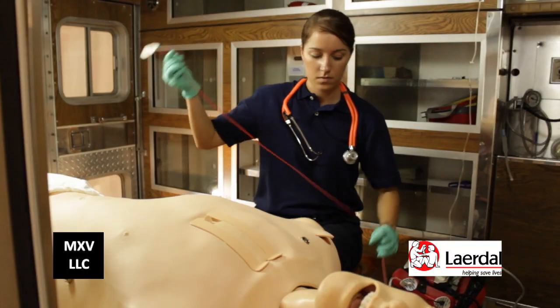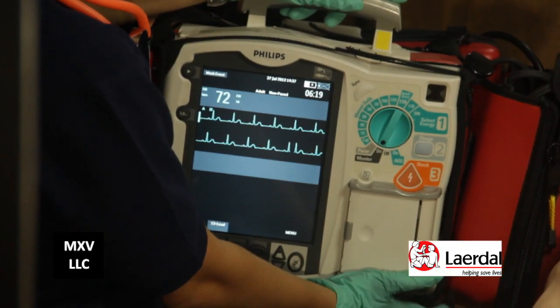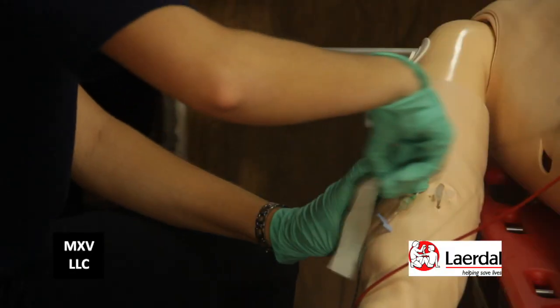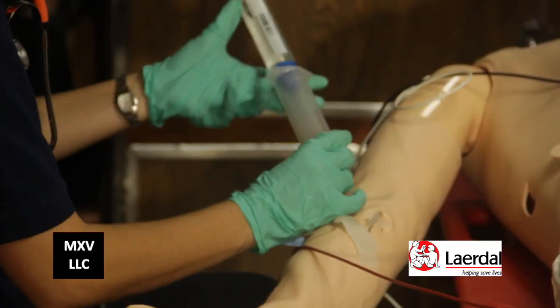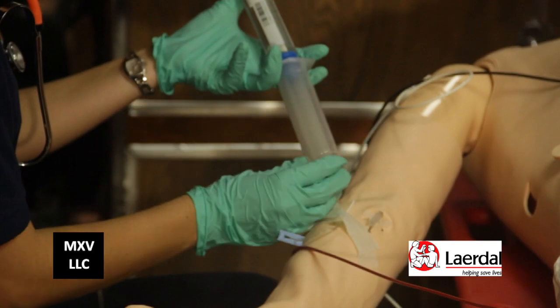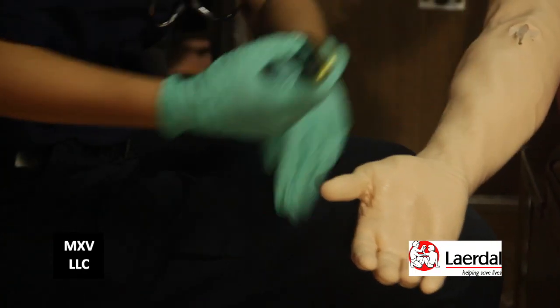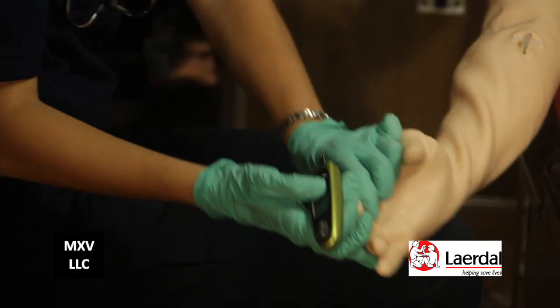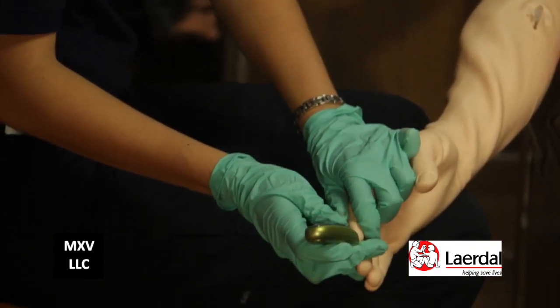After placing a 3-lead EKG, a normal sinus rhythm is observed. IV access is initiated and D50 is administered. The patient is reassessed, including a second blood glucose level, to see if the D50 has helped.